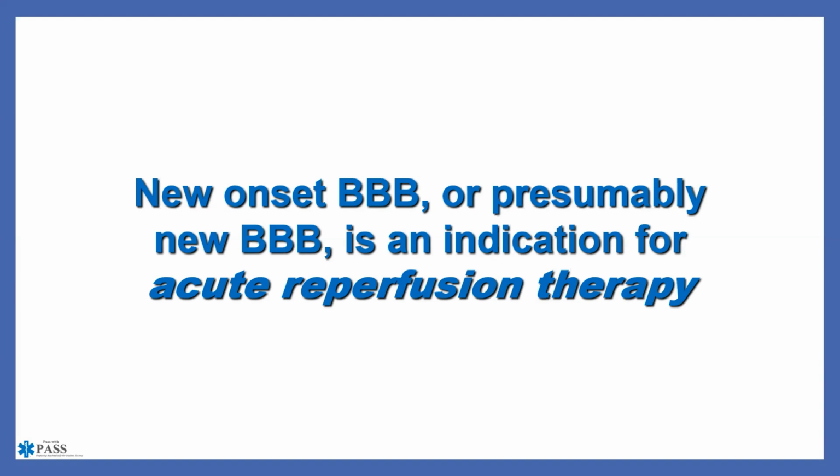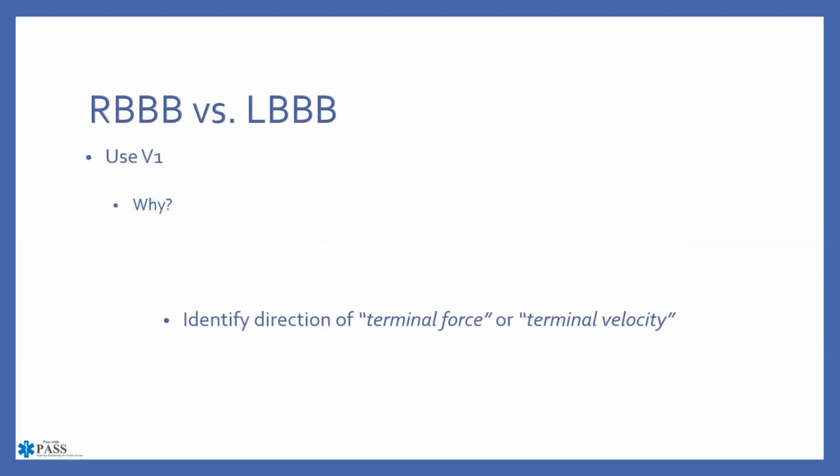If they don't have one on file, this person has probably just got themselves a trip to a cath lab for reperfusion therapy, or at a minimum, they're going to end up starting them on some medication to try to reperfuse them, because it is a presumptive block until proven otherwise.